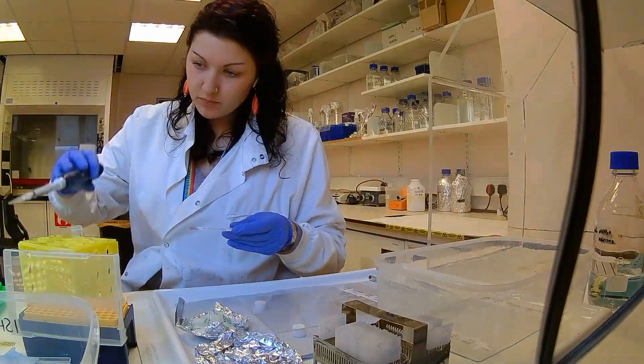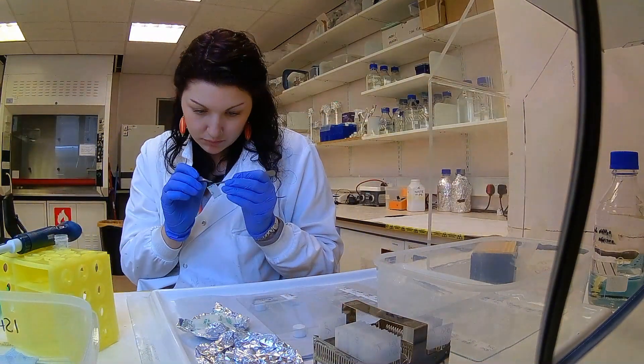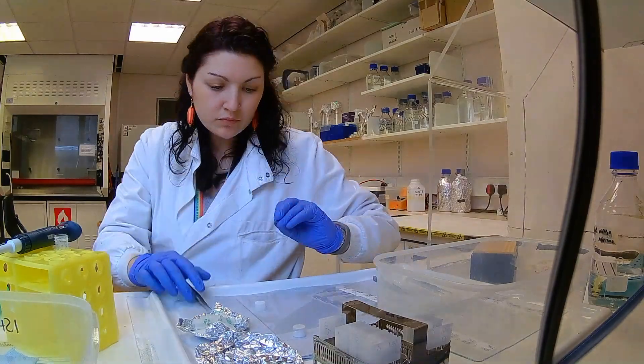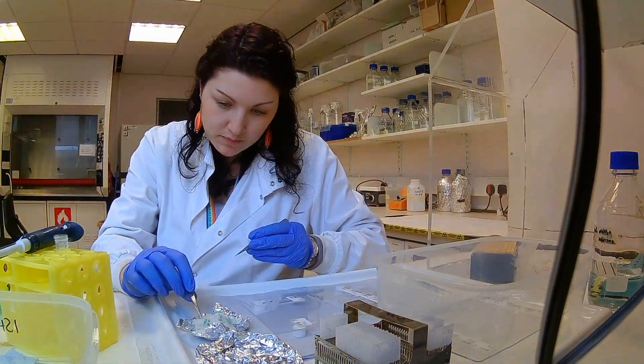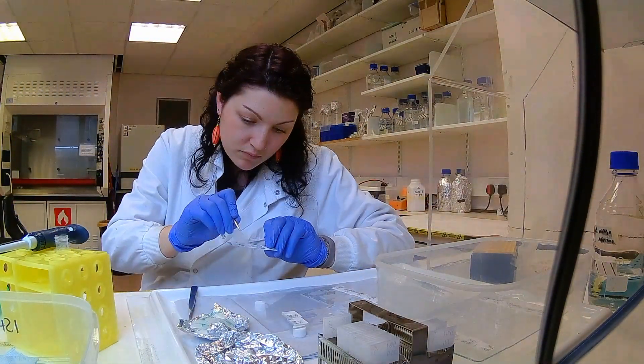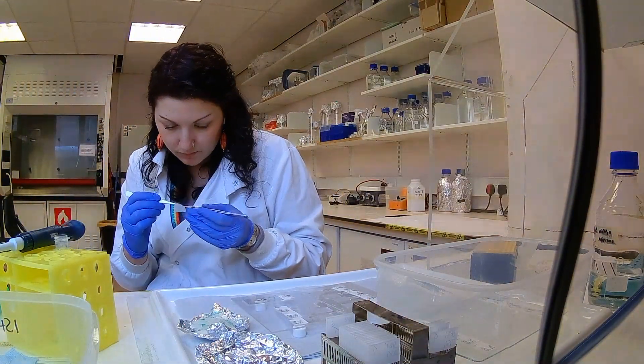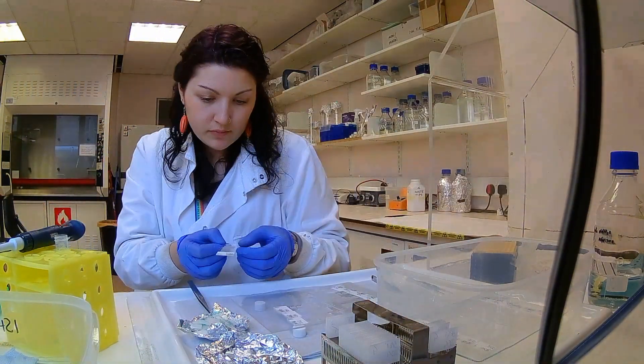Finally, I'm ready to put the probes on the brain slices. I calculate how much probe needs to go onto each slice because I want the concentration to be the same across the board so I can then compare them. I add the probe to a mixture, which is generally a buffer that helps the probe bind better and more efficiently.